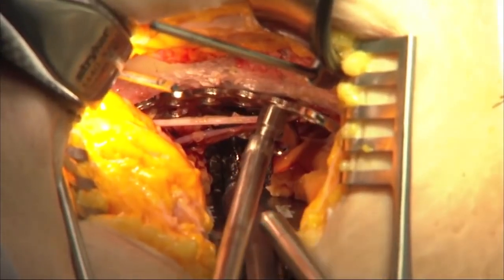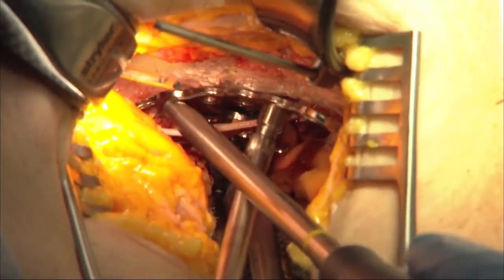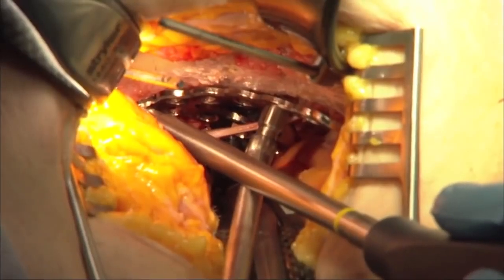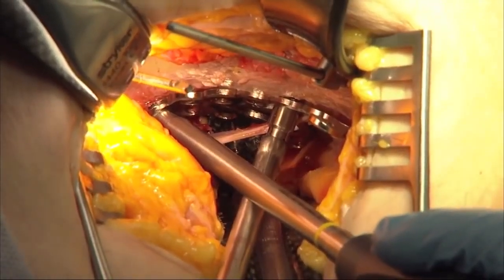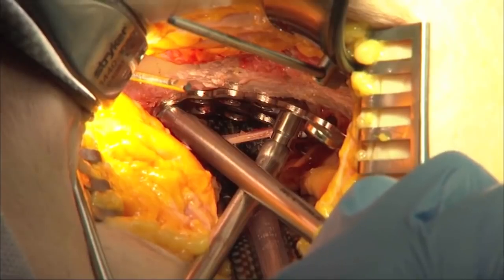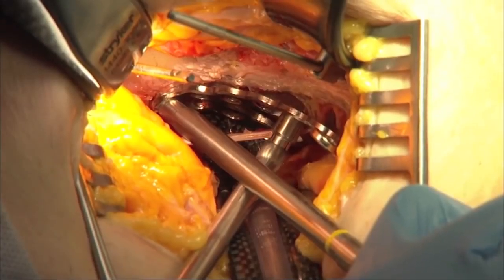It sits along the quadrilateral surface, and then we can use the plate screw insertion device again to protect us from having the pelvic viscera and the nerve damaged by the drill, and also to nicely position the screw into the plate. So we're going to use the plate screw insertion handle to put a screw into the most posterior hole of the plate, and this is just lateral to the sacroiliac joint.